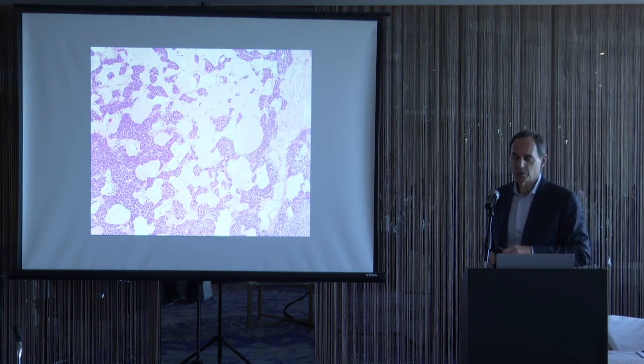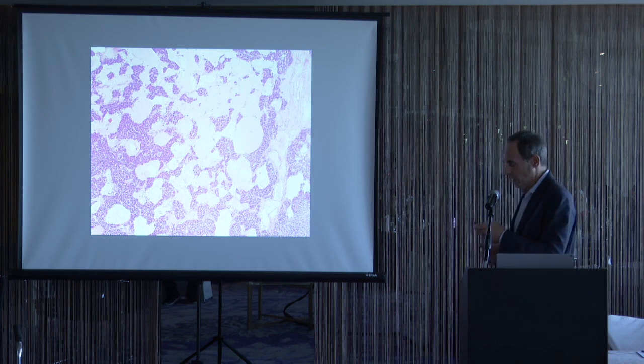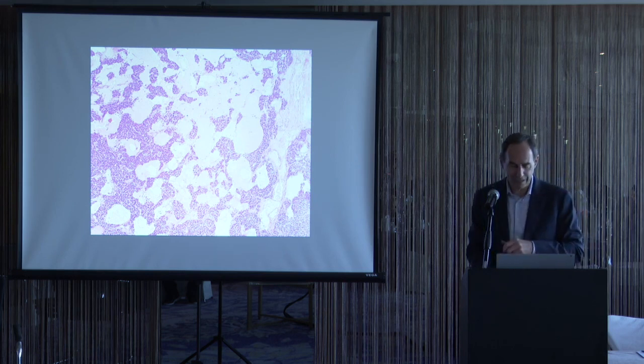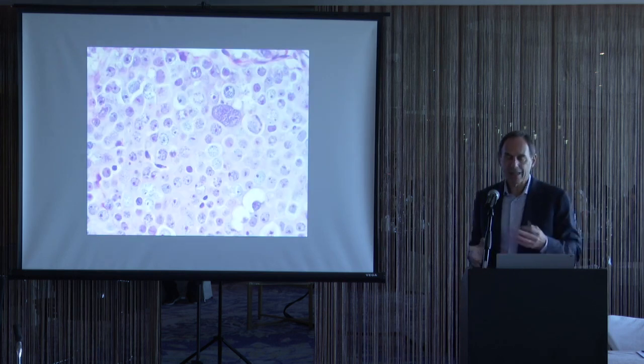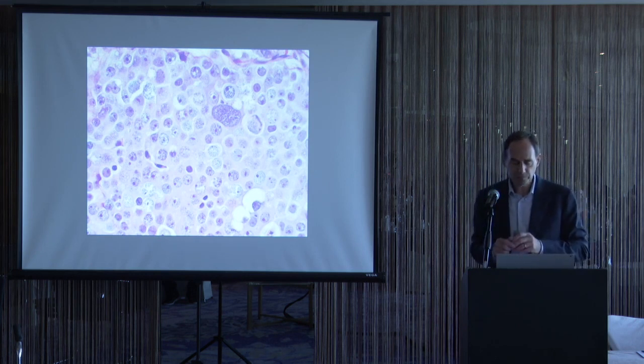So at low power, spermatocytic tumors often have a myxoid, a mucinous kind of matrix, and you can appreciate that even in the gross. And so you can often see these acellular, myxoid, mucinous pools in spermatocytic tumor, not something you'd see in a seminoma. And then the classic finding in spermatocytic tumor is 3 cell types.